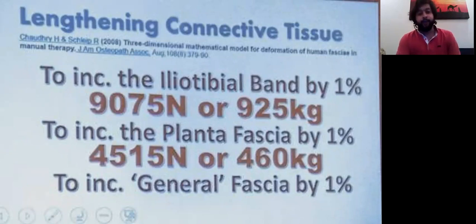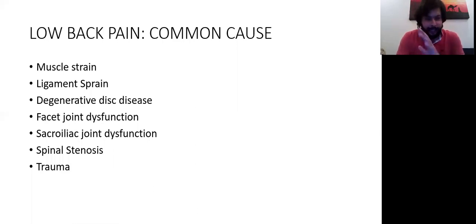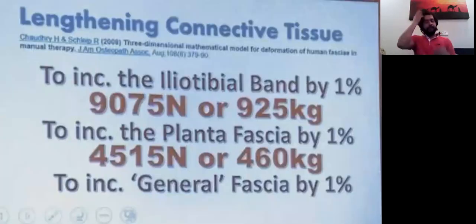Let's move forward. Low back pain. So let me quickly go through all about the IASTM and these things. It's a myofascial therapy. It's a quick summary. What you are specially using is a tool, whether it's a metal tool or something else. Even some people are using a wooden tool also. In gua sha, people used wood before to release the muscles.